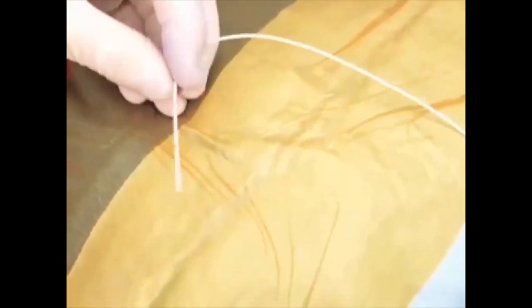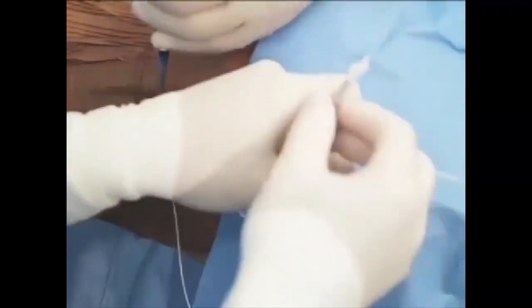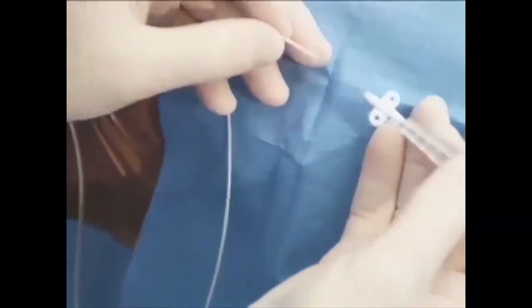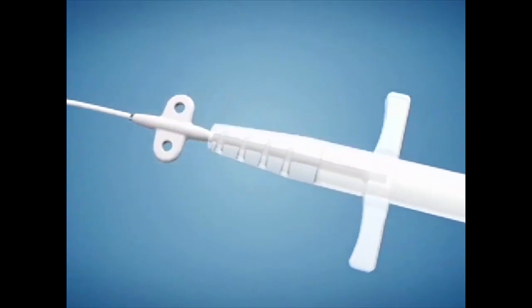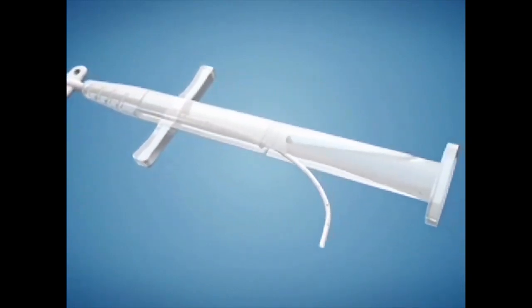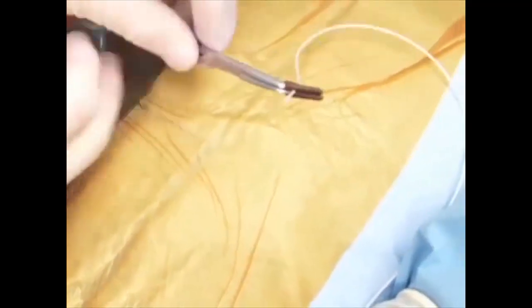After confirming CSF flow, use rubber-tipped forceps to clamp the end of the catheter to the drape above the incision site to prevent CSF loss. Locate the anchor dispenser and attached anchor. Unclamp the spinal segment of the catheter and thread the catheter into the metal tip of the anchor dispenser until the catheter exits through the dispenser slot. Using rubber-tipped forceps, reclamp the spinal connector end of the catheter spinal segment to prevent CSF loss.